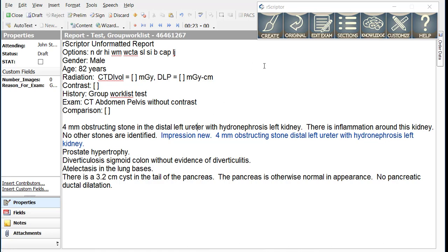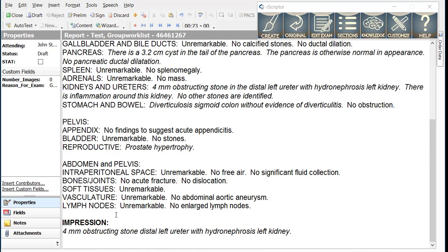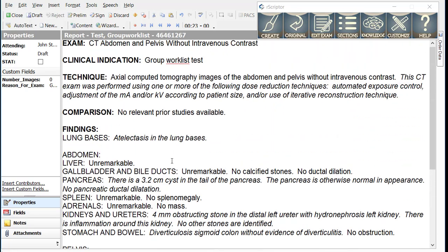When we create the report, we will see that R-Scripter put the text in the impression and also put the appropriate text in the findings section.